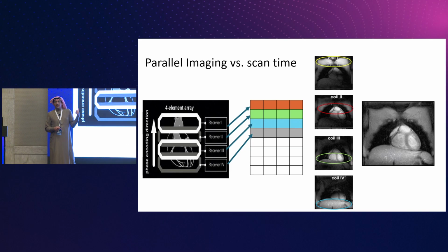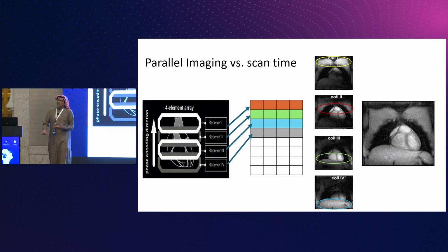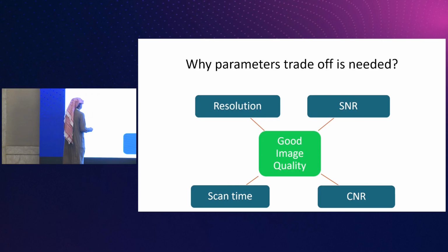Agree? We all apply parallel imaging, especially with cardiac. You cannot do cardiac without parallel imaging. Actually, it's a preset. Okay.